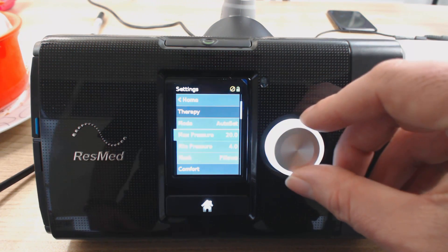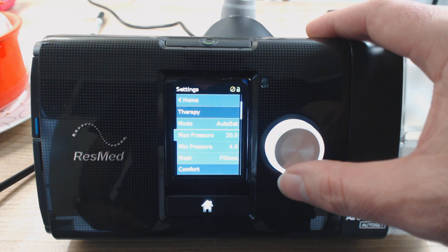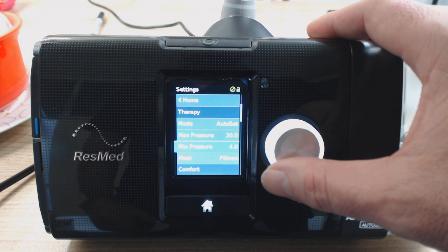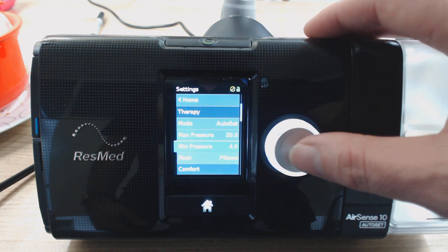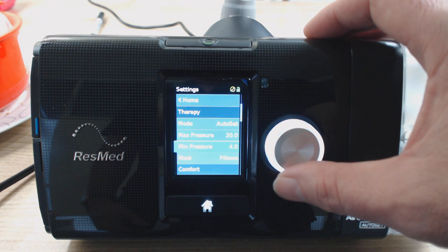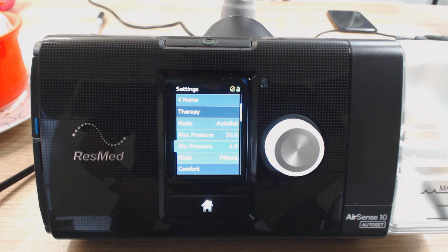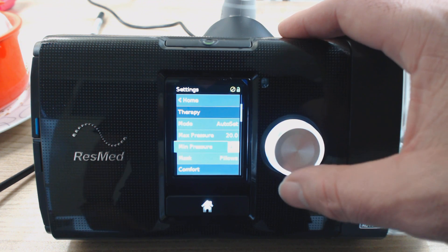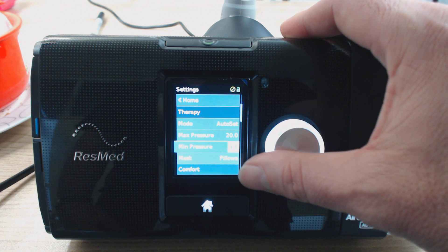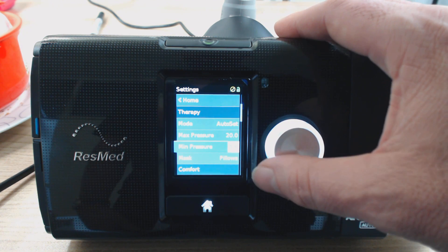If we go down a little bit, you've got your max pressure, which says 20 at the moment — that's the upper limit of the automatic algorithm. And below that you've got min pressure, which is your lowest limit. Four is as low as you can go and 20 on the max is as high as you can go — that's the widest range available. Some people like to increase the min pressure a little bit if they feel like there's not quite enough air coming through the mask, if it's feeling a bit suffocating.